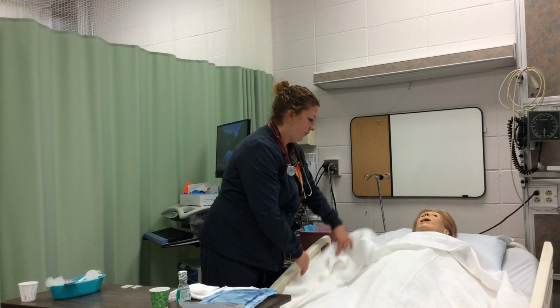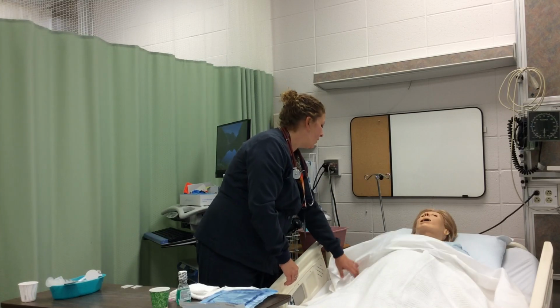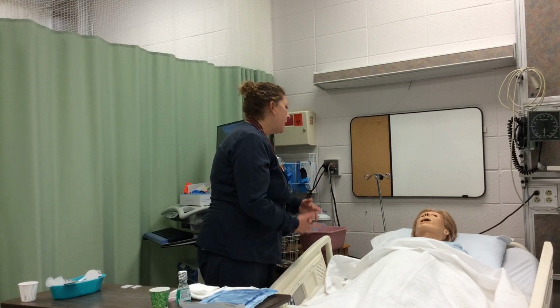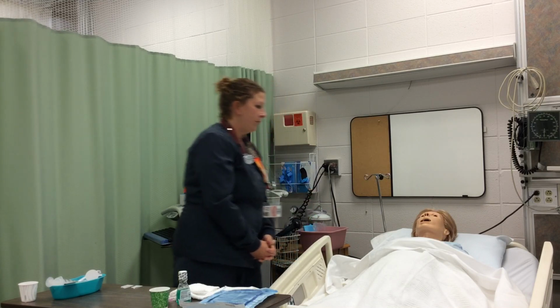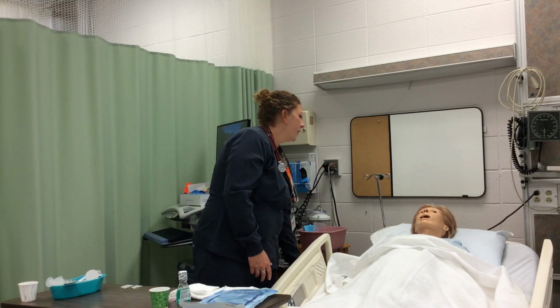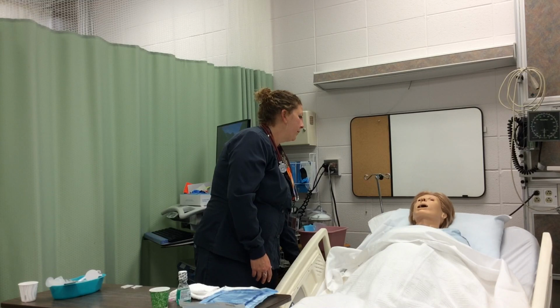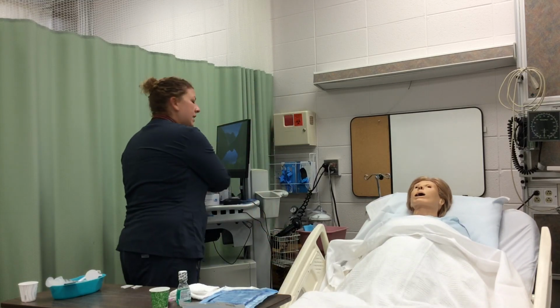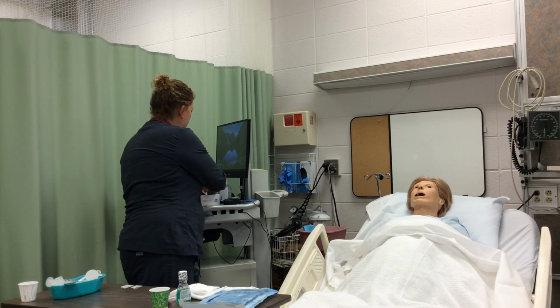Explain the procedure. I'm going to be inserting a nasogastric tube. So there's going to be a tube in through your nose and into your stomach that's going to help drain your stomach and hopefully help you to feel better. Assess the patient's cough and gag reflexes. I'm going to have you sit up. Can you cough for me deep from your chest? Good.